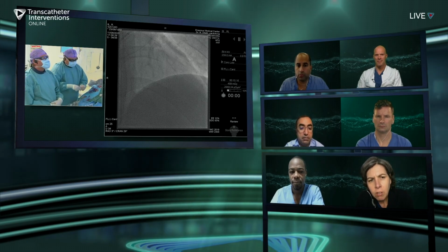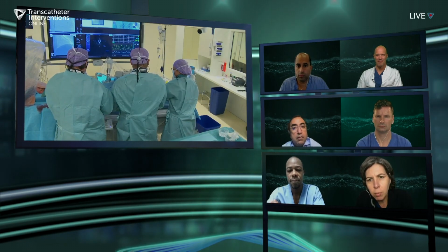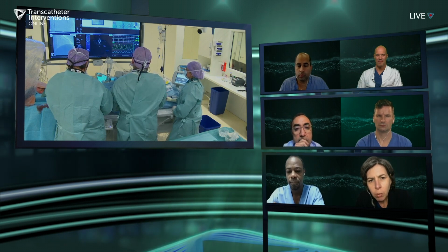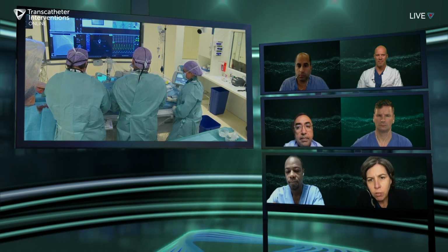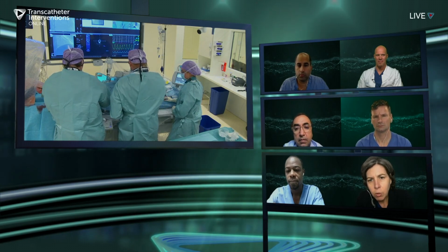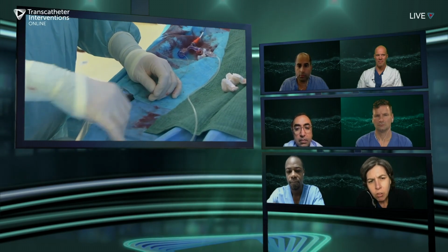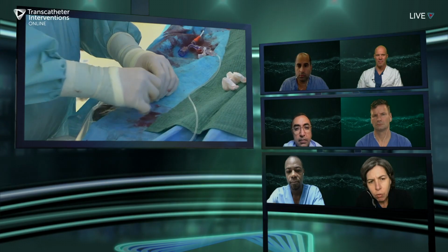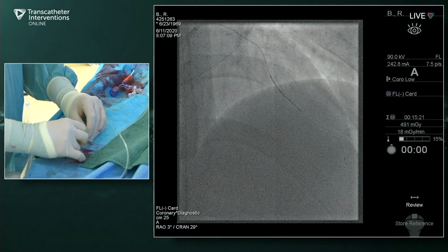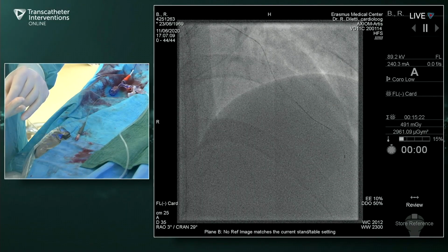The other thing I didn't really see, which I'm sure the guys have looked at, was the location of the distal cap. So if the distal cap here was proximal to the bifurcation, I would think about doing ADR before retrograde for safety reasons. But if the distal cap obviously is at the bifurcation, then I would commit to going around the epicardial. In a situation like this, where you have one dominant collateral, you have to be very aware that you might make the patient ischemic or cause hemodynamic compromise. So you always have to have that in the back of your mind.